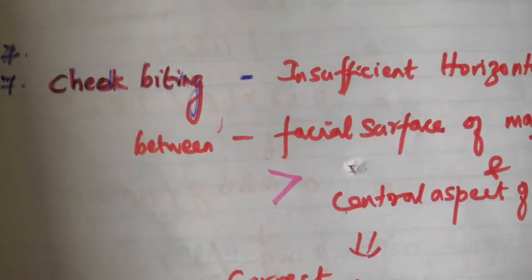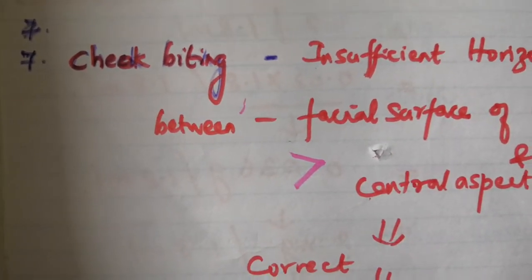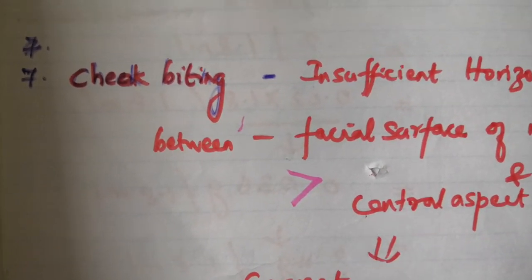So this is the overall view of the checklist which you have to do during the insertion of denture.